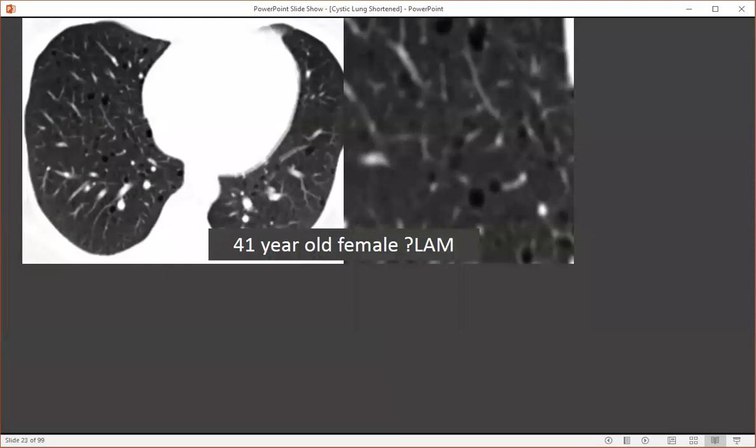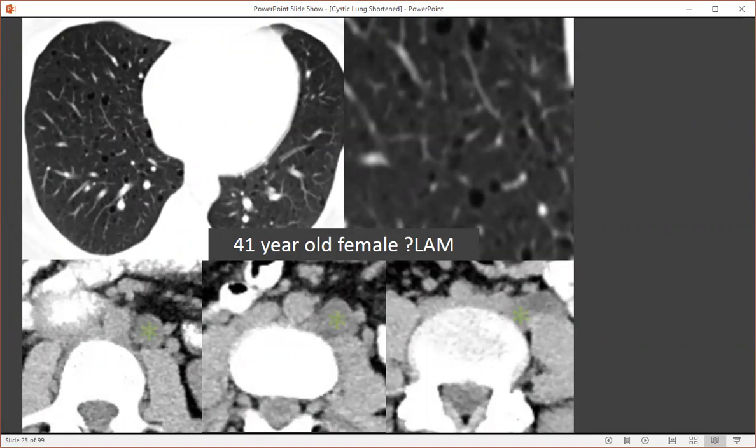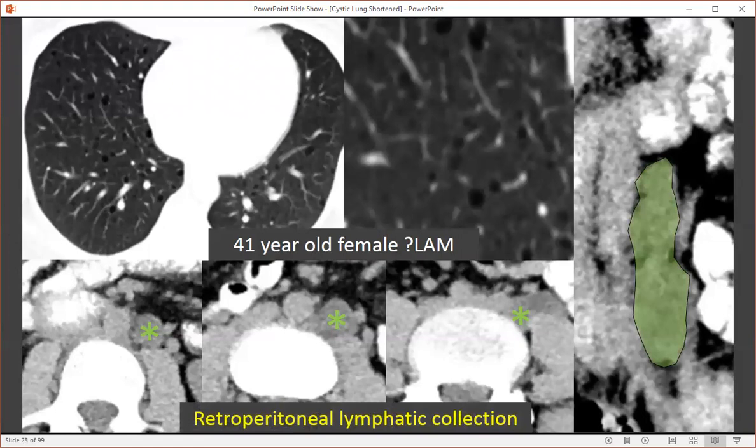Here's a 41-year-old female with a questionable history of LAM based on CT. I think we can make a confident diagnosis: uniformly distributed cysts of shape and size affecting all lung zones. In her upper abdomen, she did have an abnormality adjacent to her psoas musculature — an elongated fluid collection reflecting a retroperitoneal lymphatic fluid collection. Lymphatic fluid collections can occur in the retroperitoneum or posterior mediastinum in the setting of lymphangiomyomatosis.